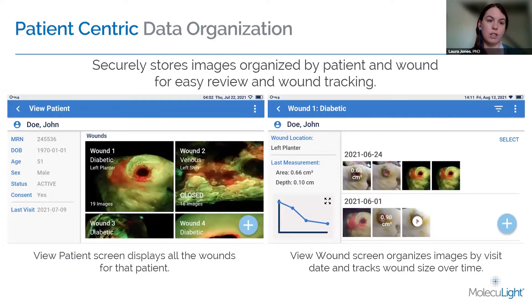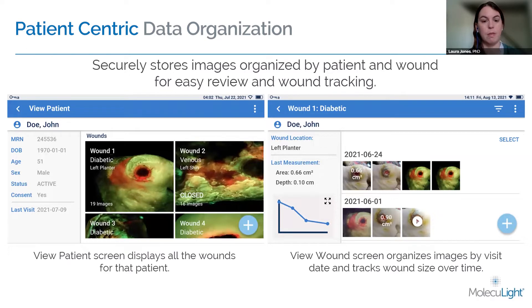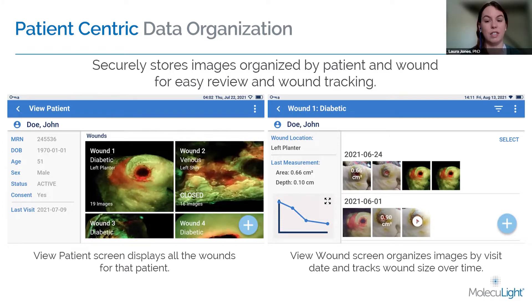The DX features a patient-centric data organization, so the device will organize all the images by patient and by wound, allowing you to track what's going on with the wound visit-to-visit, including differences in wound size and differences in fluorescence, which will really help you detect these elevated bacterial loads.